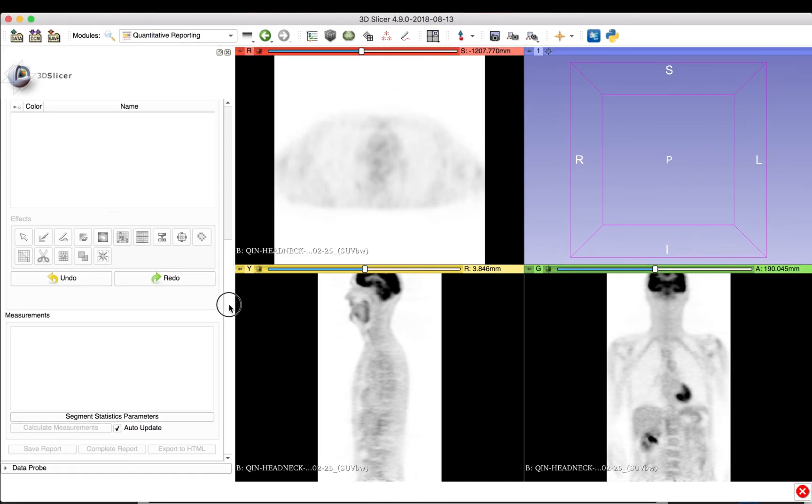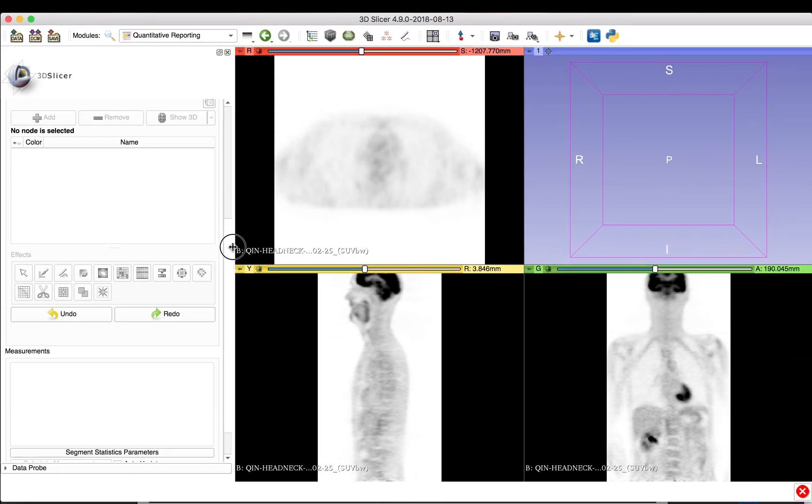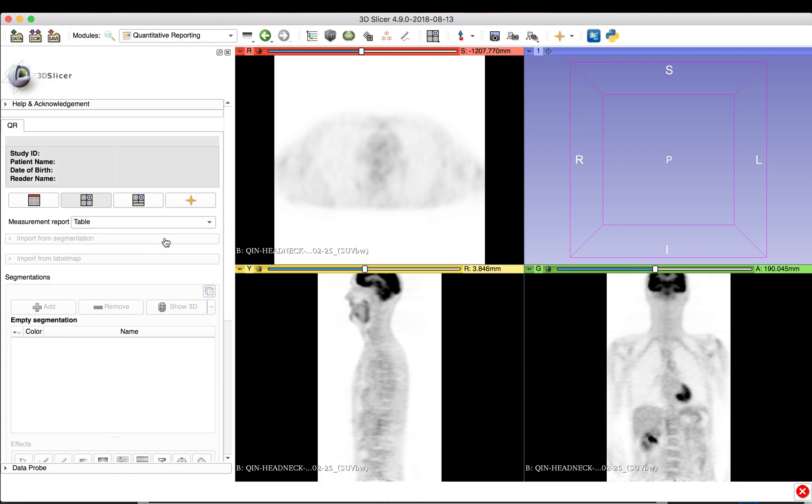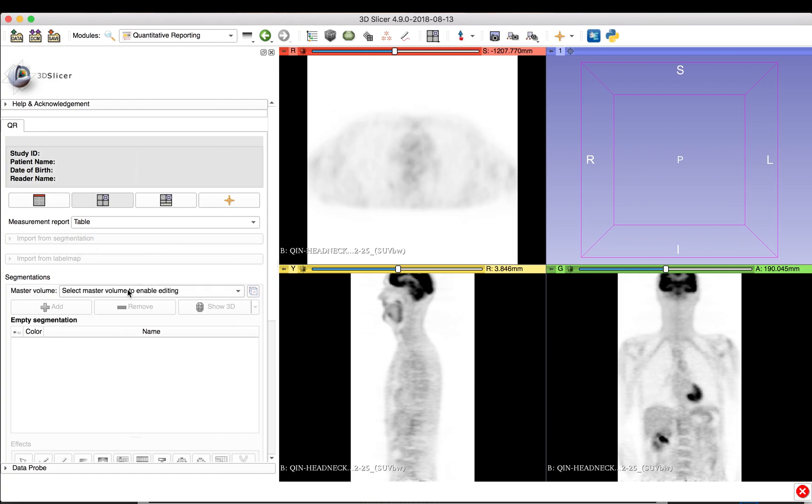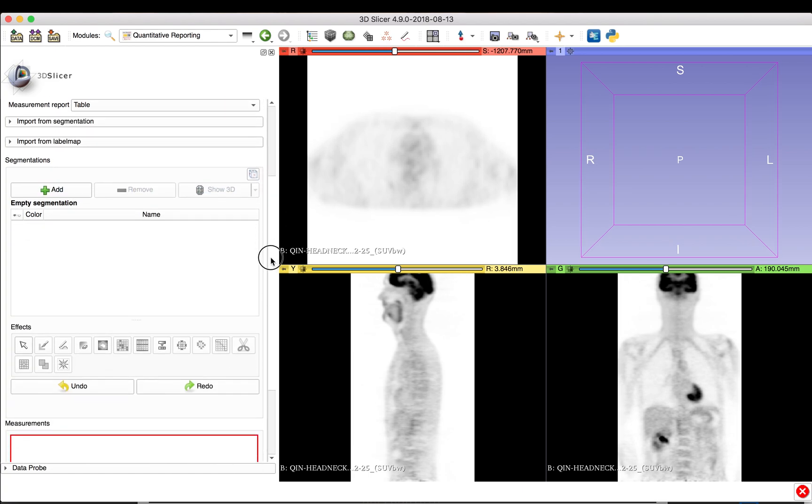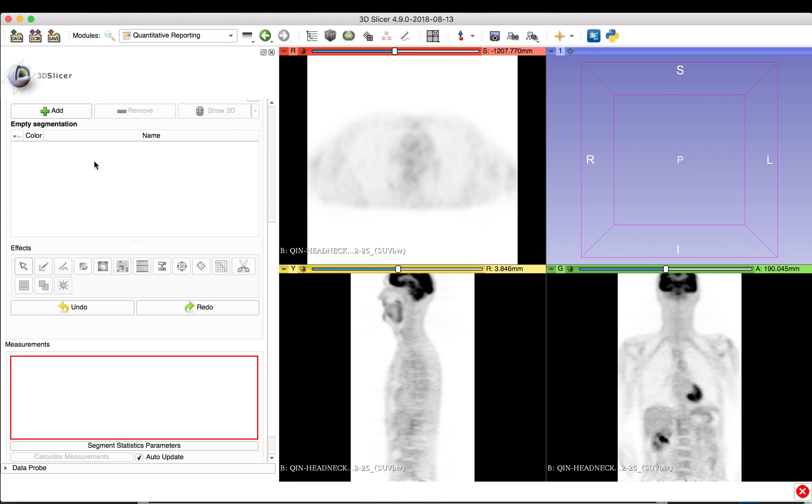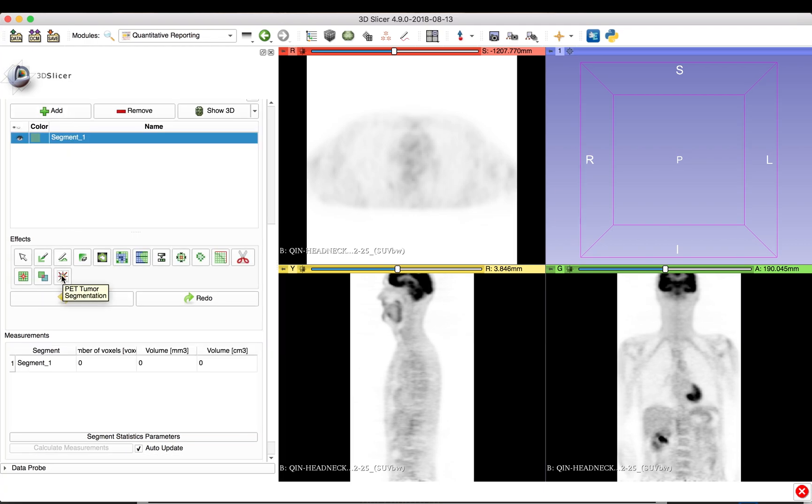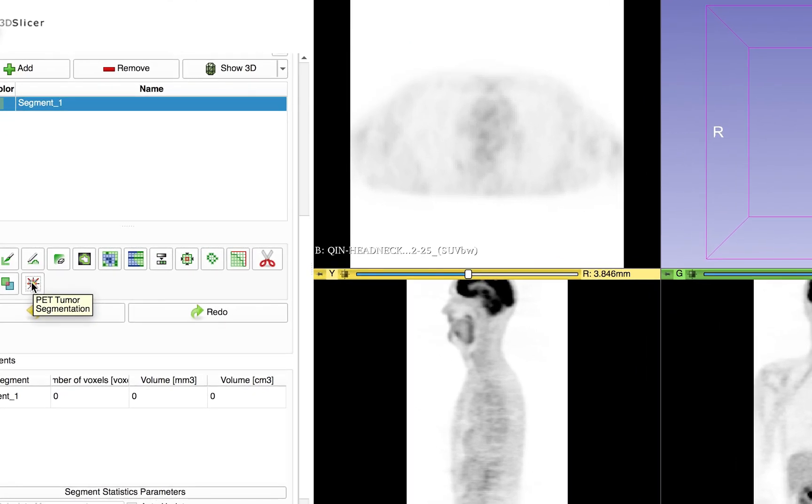To start with the Quantitative Analysis, we create a new measurement report and assign it the loaded PET scan that we want to analyze. For the segmentation of lesions, any of the segment editor effects can be utilized. We will use the PET tumor segmentation effect, which was designed specifically for this task.